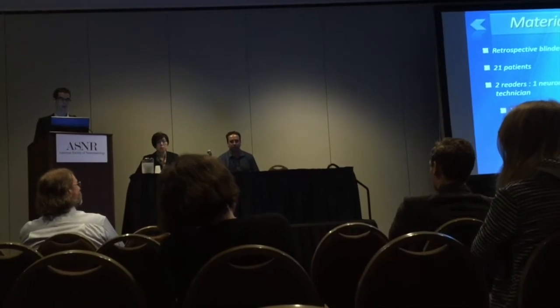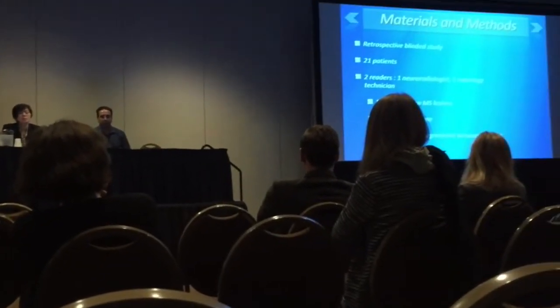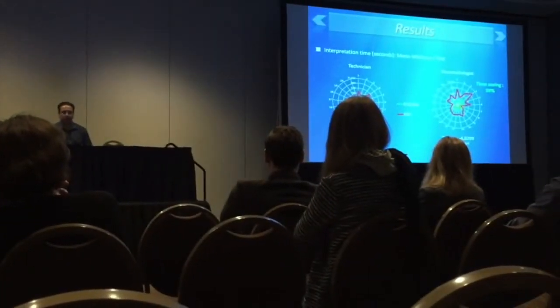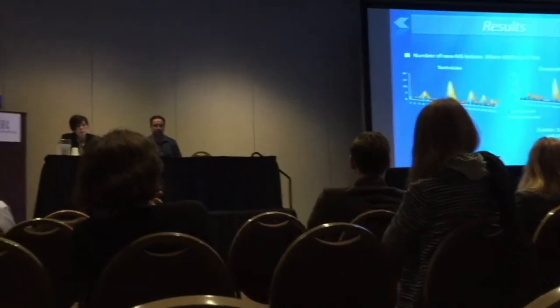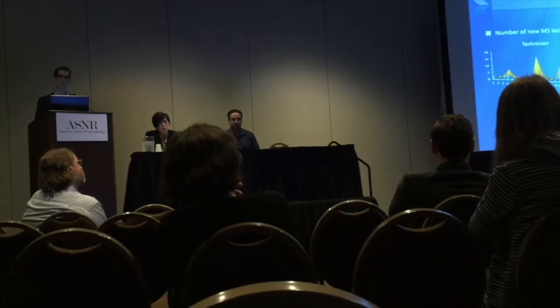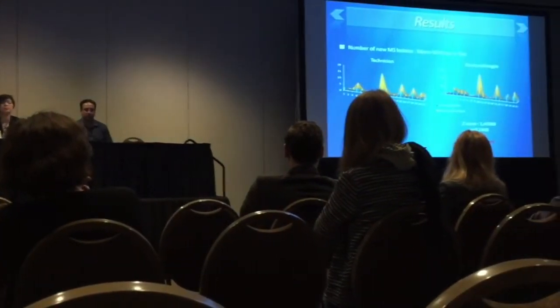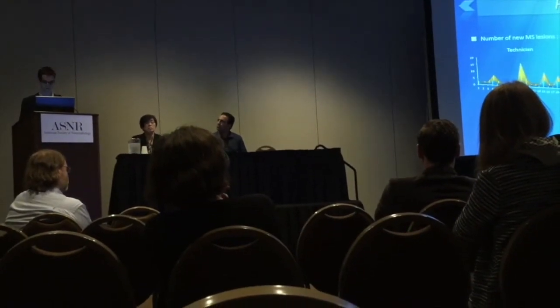We assessed the number of new MS lesions detected, the time needed for interpretation, and the agreement between readers with both techniques. The time for interpretation is significantly reduced for the neuroradiologist, about 60%, not for the technician. The number of new lesions detected, whereas not significant, probably because it is frequently similar for both techniques, is sometimes higher with FLAIR fusion, but never lower than with frame-by-frame comparison. So the gain of time is not associated with a decrease in the number of new lesions detected.